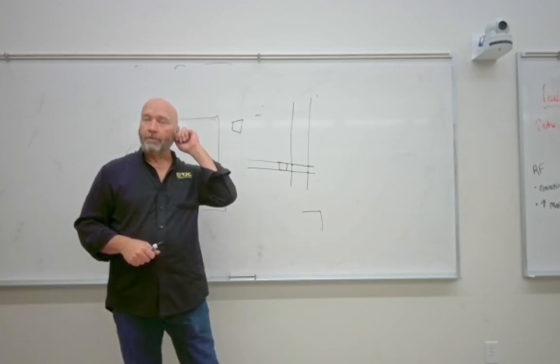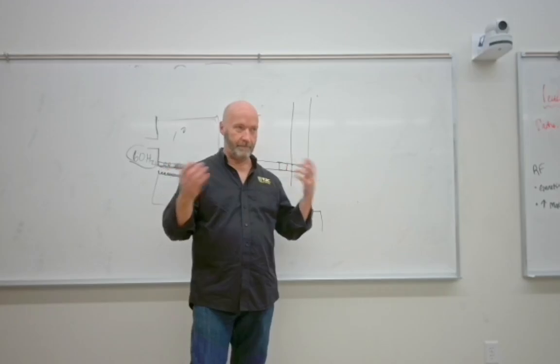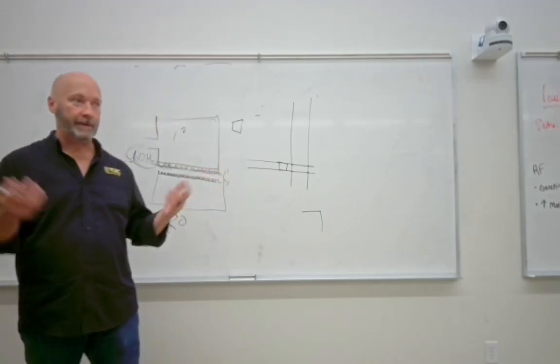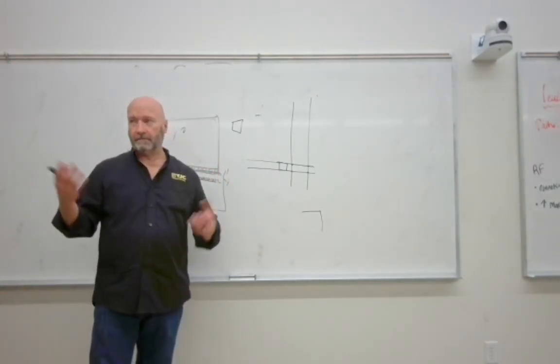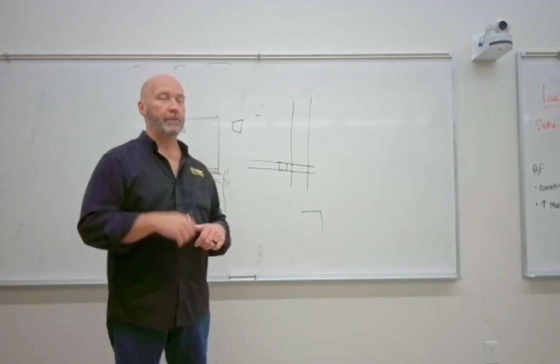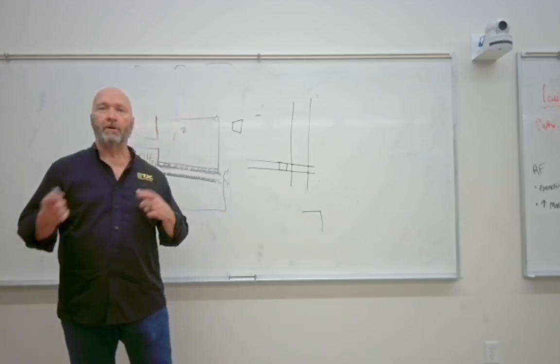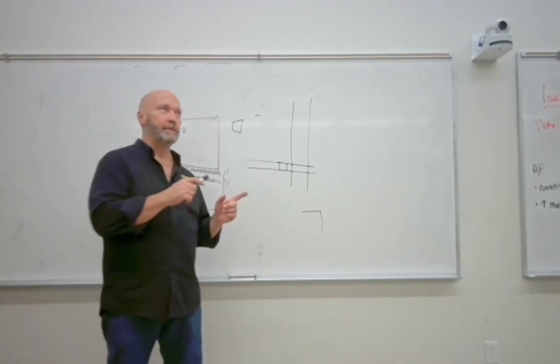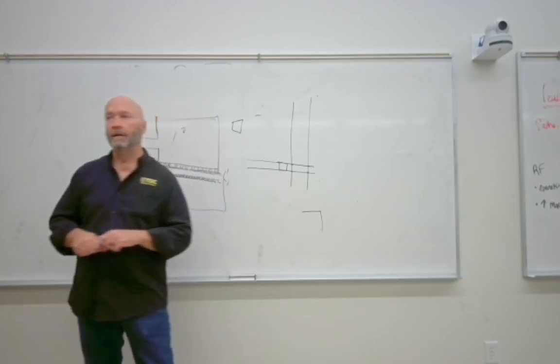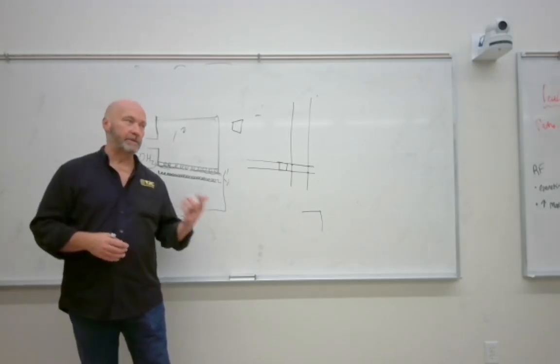And then what we refer to as RF rooms, they have a kind of a combination of a couple of different things. One is fluoroscopy, and it can be high kVp, low mA, but they've also got the same capabilities as a diagnostic radiography room. So what we refer to them as are RF rooms, radiography and fluoroscopy rooms. Okay. So any kind of exam that you need to take in diagnostic radiology, you can complete in that.